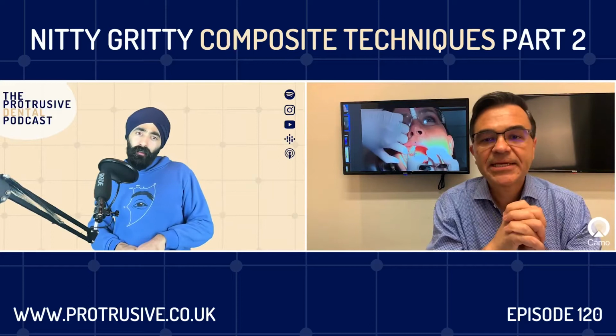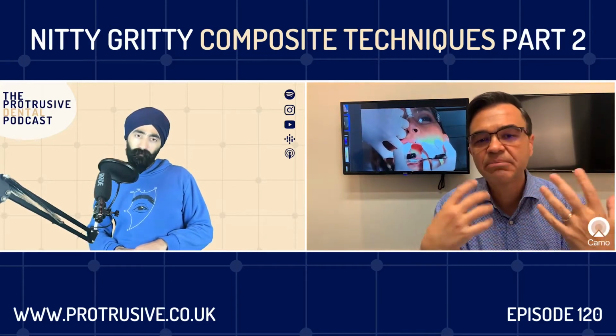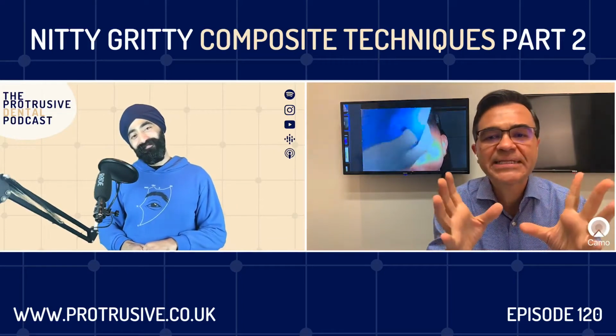I do split dam technique because I don't like to do it individually and go clamp by clamp, because I sometimes get bleeding and, like I told you, I'm not such an agile dentist. So I do split dam technique, and I'm showing a video here on how I do it. And it only takes me 2 minutes to place it.